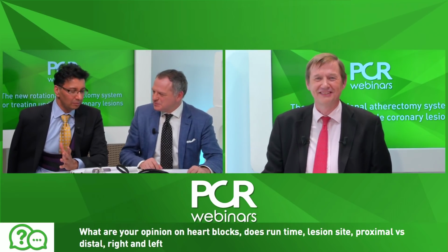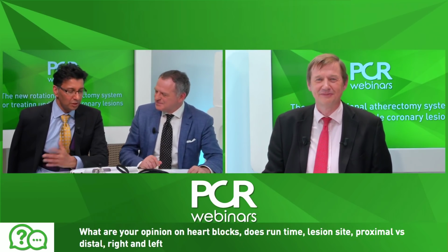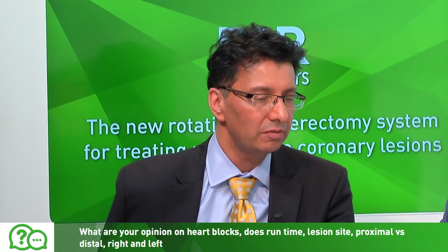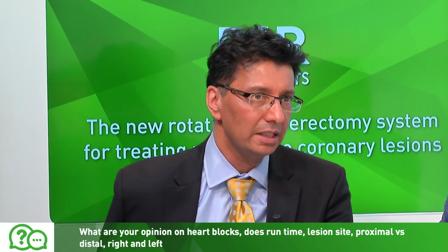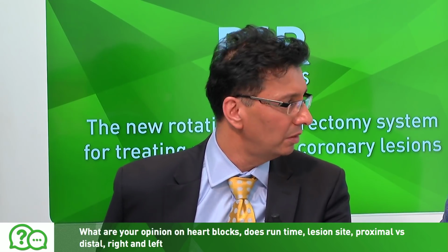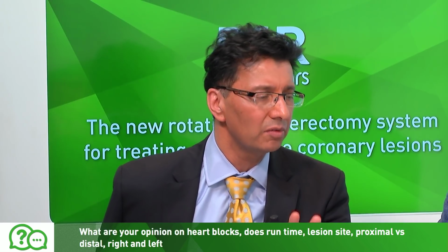So, my reading of the situation is that in nearly all cases it occurs in a dominant right or dominant circumflex, rarely in the LAD, and it's believed to be just due to particulate debris going down the AV nodal artery. It's always transient, but obviously can destabilise a patient.